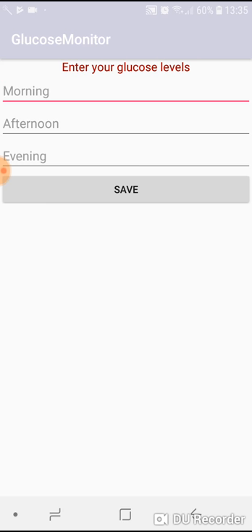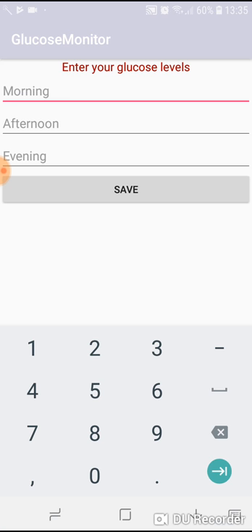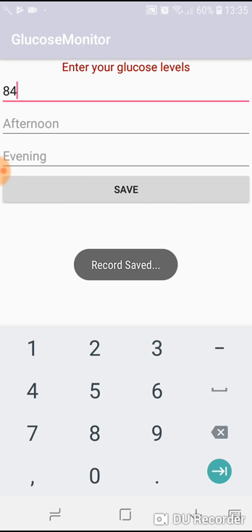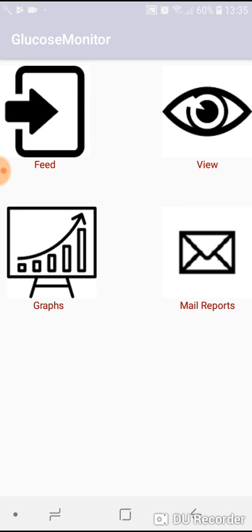Let's see feed. There are three values: morning, afternoon, evening. Anytime in the day you can monitor and feed values. For example, in the morning the value was 84. Press save. So this record was saved. Go back.